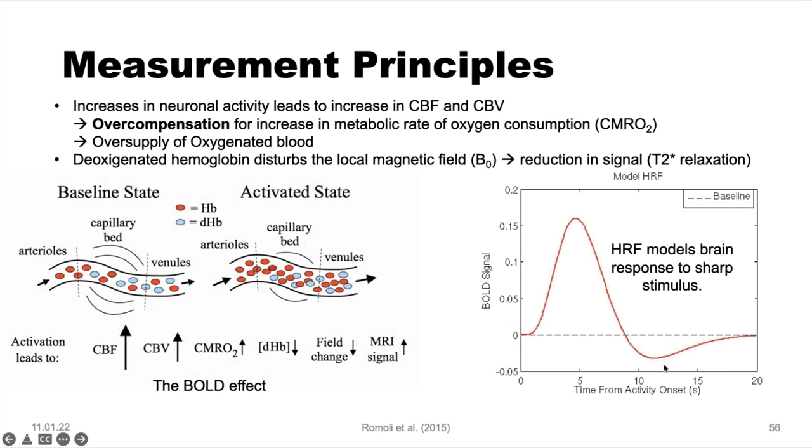This is quite indirect because we measure blood flow, and this signal can then be modeled with the hemodynamic response function. So it's kind of a chain of responses from a stimulus through to neuronal activity, and then finally to a measured signal. And this is all governed strongly by the blood's response to the stimulus, which can be characterized by this function, the hemodynamic response function.